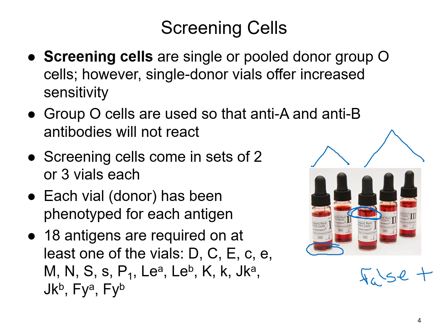So remember that hemolysis is considered a reaction. If we have this in our tube when we test it against our patient, it's really the screening cells that have that hemolysis, and not just because of an actual reaction, or rather, we don't really know if there was a hemolytic type of reaction due to that particular antibody. So we would not want to use these.